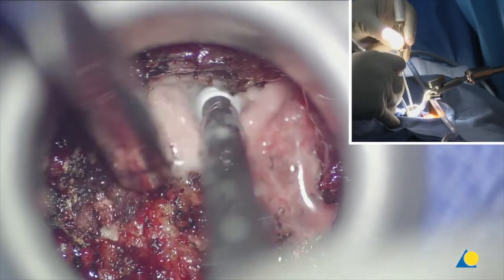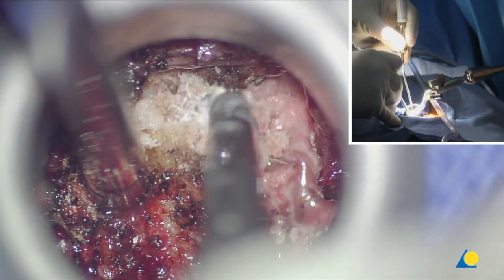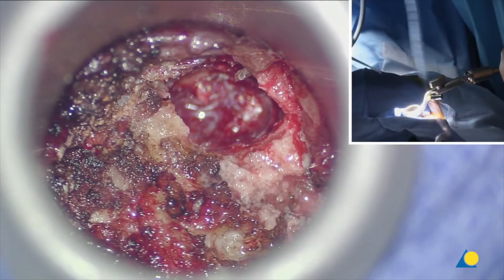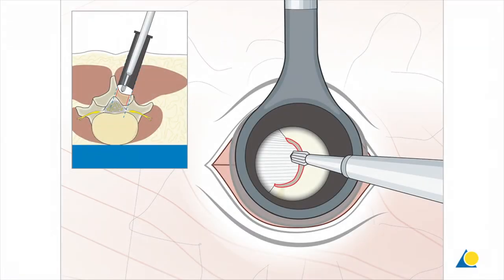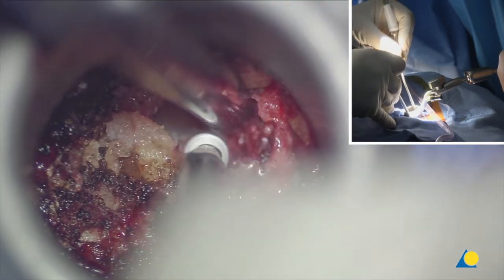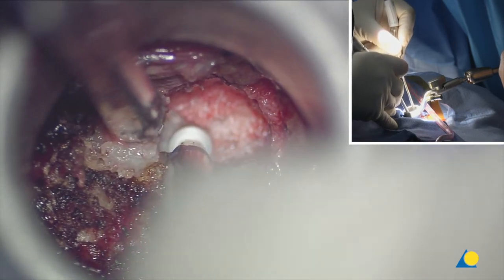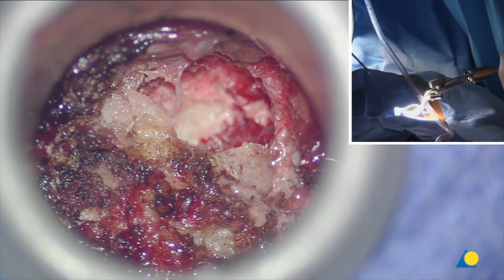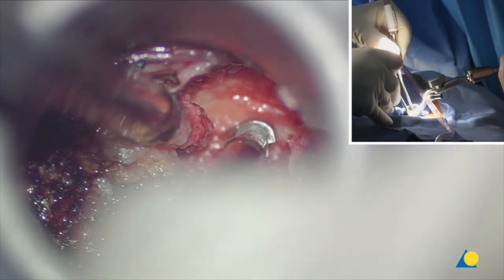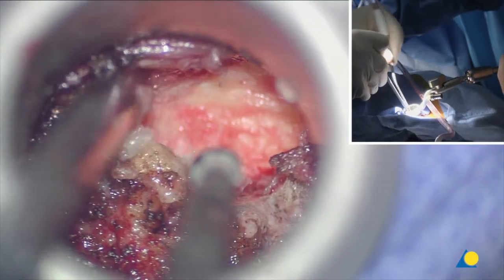The next step is trying to identify the yellow ligament — the ligamentum flavum. Once I see the ligamentum flavum, I'm in the safe zone. I keep the tip of the drill on the ligament and remove the bone with the side-cutting bur. I don't want to get too far into the joint, but at L4-5 that is usually not a big issue. As you operate higher up in the lumbar spine, that can become an issue.